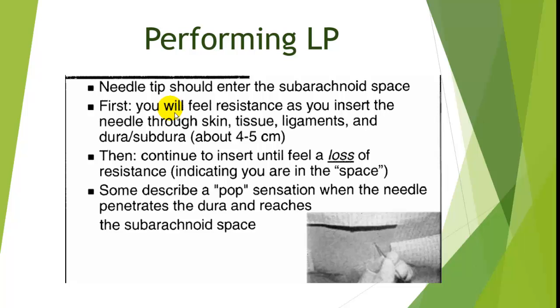And if you advance it and then it suddenly gives way and there's little to no resistance, that is the so-called pop sensation when you know that you're in the subarachnoid space, which you get a feel for pretty readily after you've done the first 6,000 or 7,000 spinal taps.